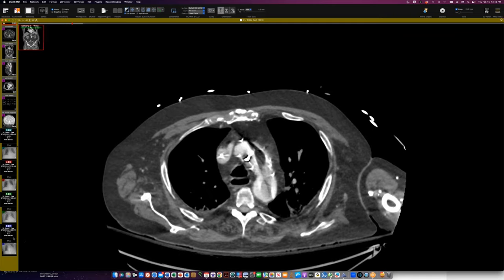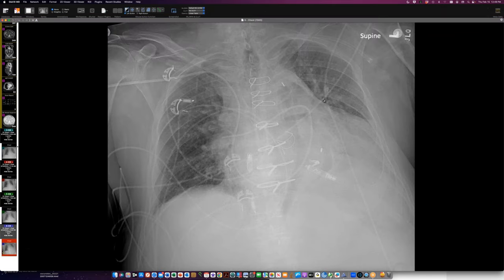This person has a left axillary intra-aortic balloon — here's the introducer in the left axillary artery. This is an upside-down balloon with a proximal marker in the aortic arch and the balloon inflated down here. A question to ask residents: what gas do they use to inflate these intra-aortic balloons? The answer is helium — you definitely wouldn't want nitrogen in there, in case the balloon burst, as you'd have a bad case of the bends.